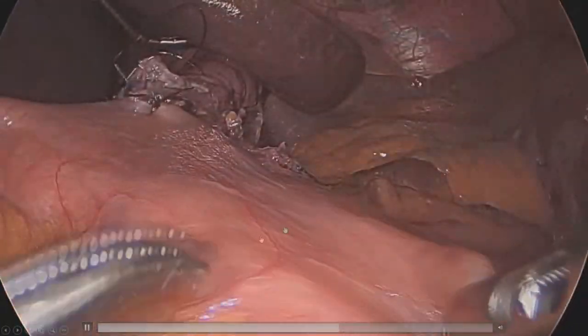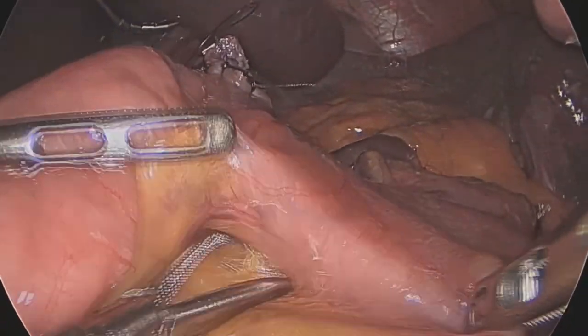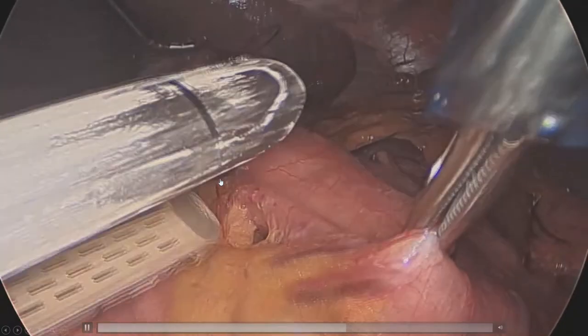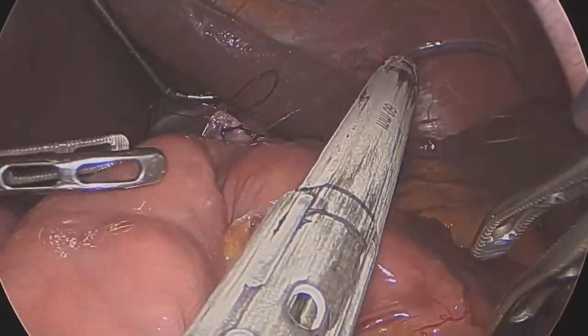The stomach size is a little bit smaller than in the first primary Roux-en-Y gastric bypass. Actually, in this video, I made the gastrojejunostomy less than 2 centimeters. Okay. And the other things are very simple and the same, so I will skip the video.